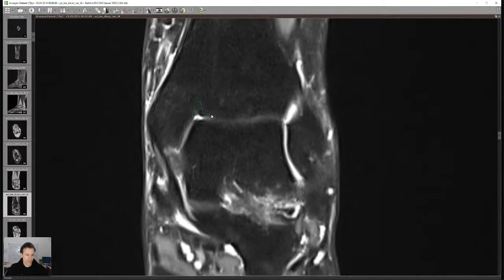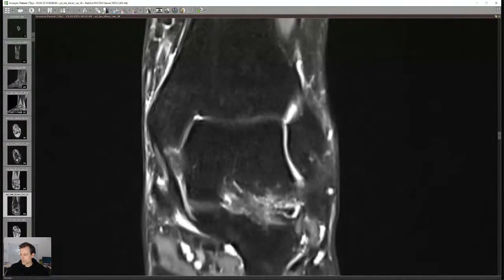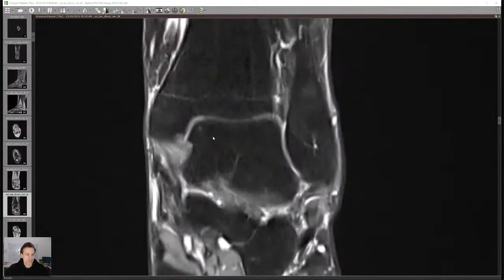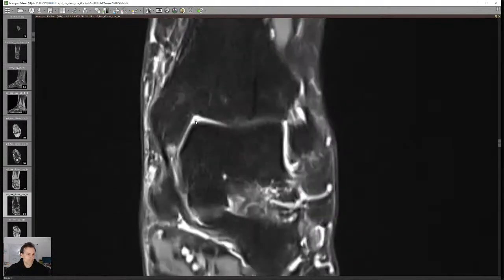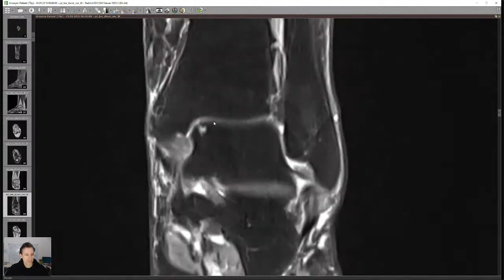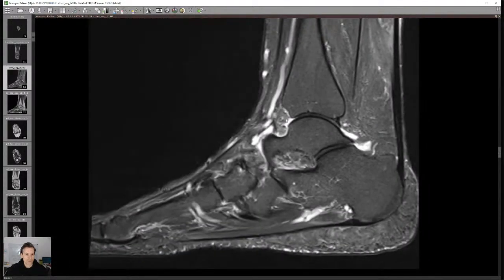Sometimes at this corner there can be a significant defect on the tibial side, but this is actually an anatomic variant called the notch of Harty. Coming back to these kinds of holes — when you see something like this, it's called the notch of Harty, an anatomic variant that should not be called an osteochondral defect.